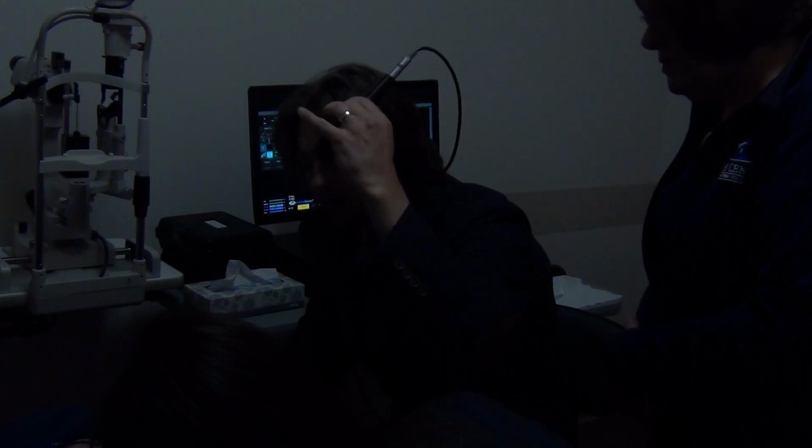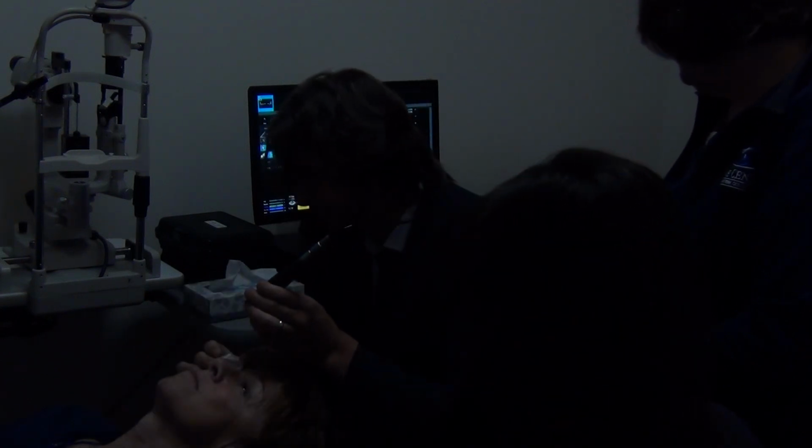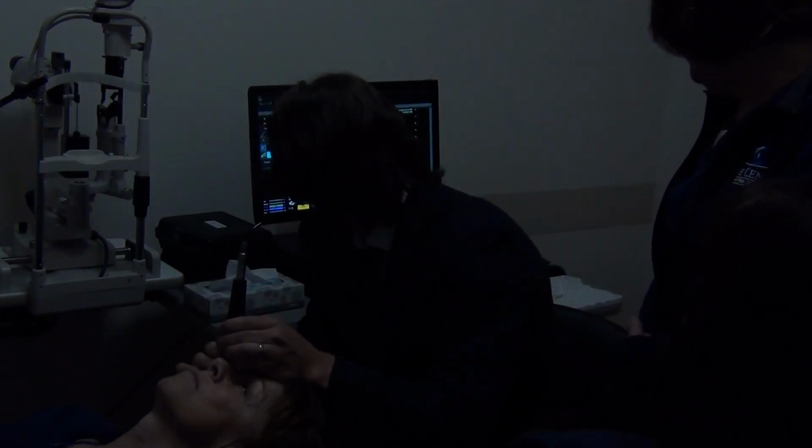So we'll do the scan first, and then I need to bring the back of the lens. Straight towards my finger. I'll do one more, again looking straight.